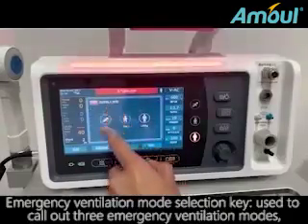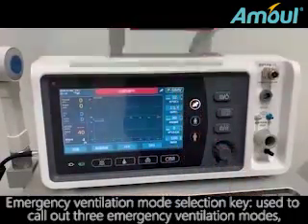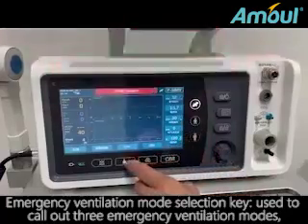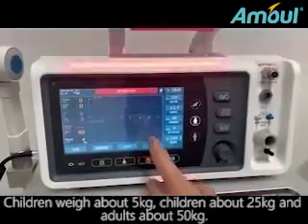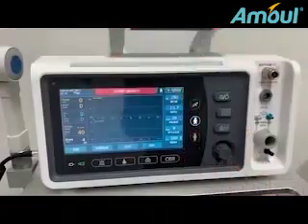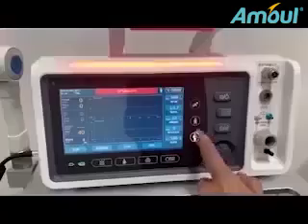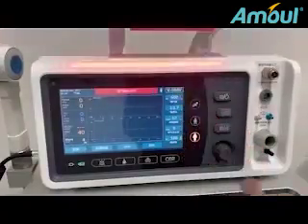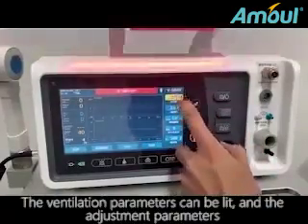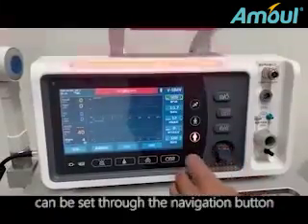Emergency ventilation mode selection key, used to call out three emergency ventilation modes: infant weighing about 5 kilograms, child about 25 kilograms, and adult about 50 kilograms. The ventilation parameters can be lit, and the parameters can be set through the navigation button.